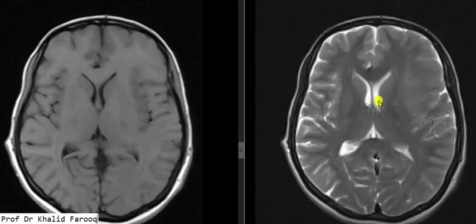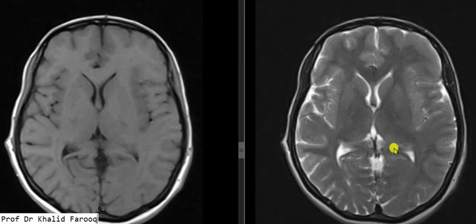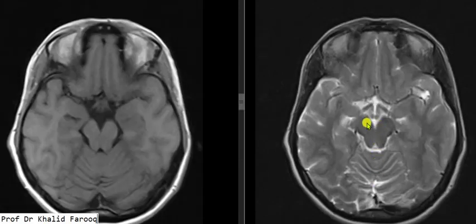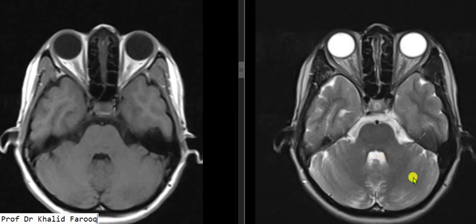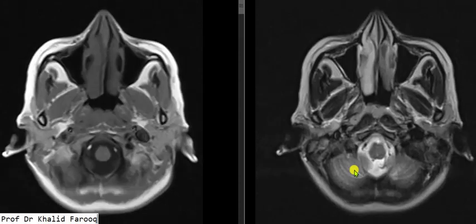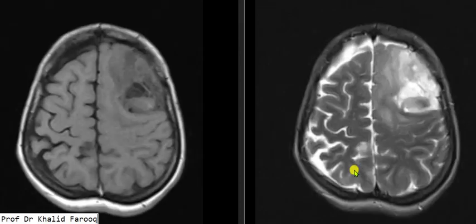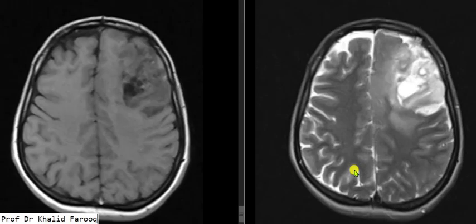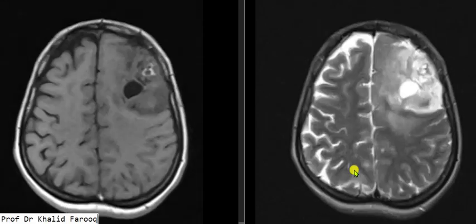The ventricular system — including the lateral ventricles, frontal horns, third ventricle, brain stem, fourth ventricle, cerebellum, and CP angles — are unremarkable. A complex mass is appreciated in the left frontal lobe. As we have only plain images, the rest of the brain is unremarkable.